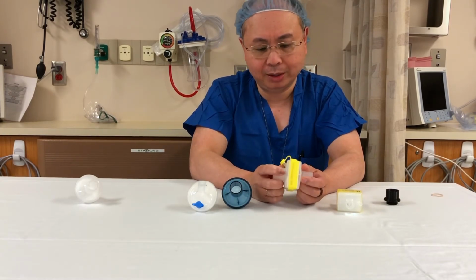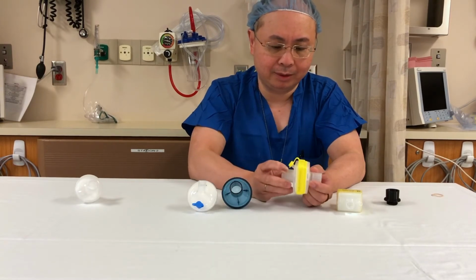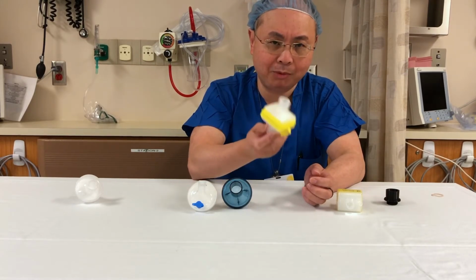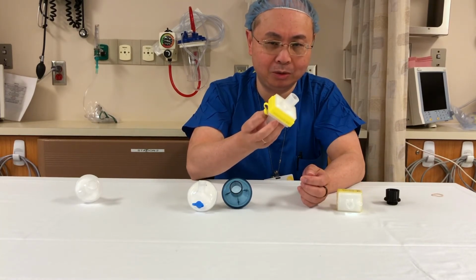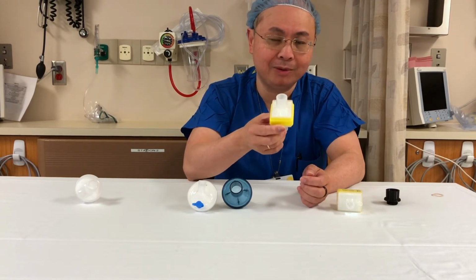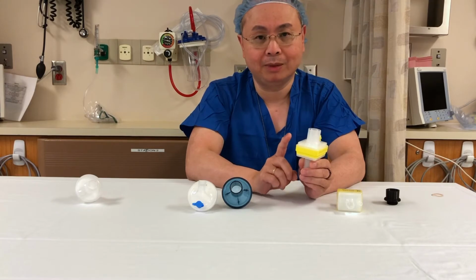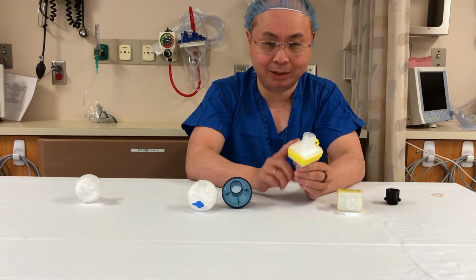Now, the French, during the COVID crisis, have been using these filters for up to 48 hours without problems. And so it's probable that you could use these for 48 hours of runtime without running into an issue. I think it's more likely to be okay in a Bunny PAPR than a ventilator, because a Bunny PAPR runs unidirectionally and does not moisturize the filter. It's a completely different environment in terms of bacterial colonization.